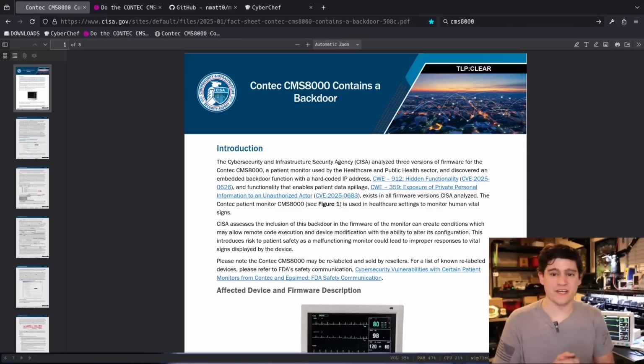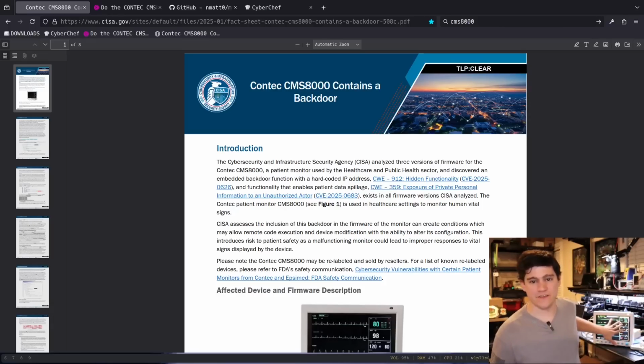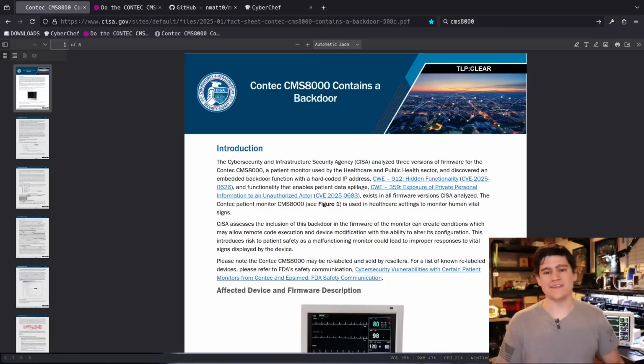So we are going to discuss that in this video, and then we're going to take a look at another claim that it is sending data in an insecure way, potentially to a server locally, potentially to a Chinese server. We're going to talk about that, and we are going to decode that binary protocol and show how we can extract clear text patient data that we see on the screen over the network. And so this is going to be a fun reverse engineering exercise, and we're going to get to just dissect some of the claims made by the United States government and the CISA agency.